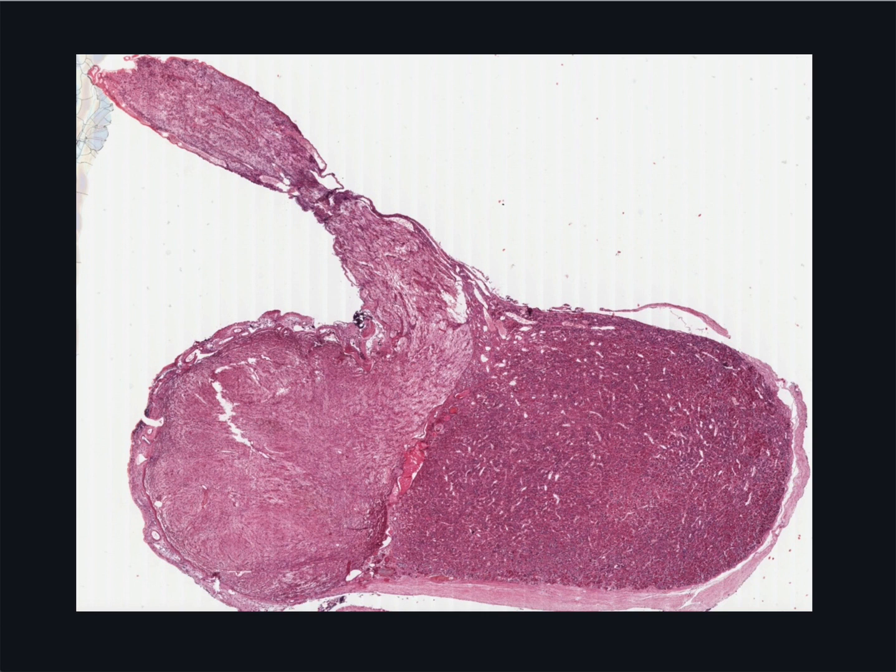Just remember that collectively the two together are called chromophils. And remember also that the chromophobes continue to stain pale.